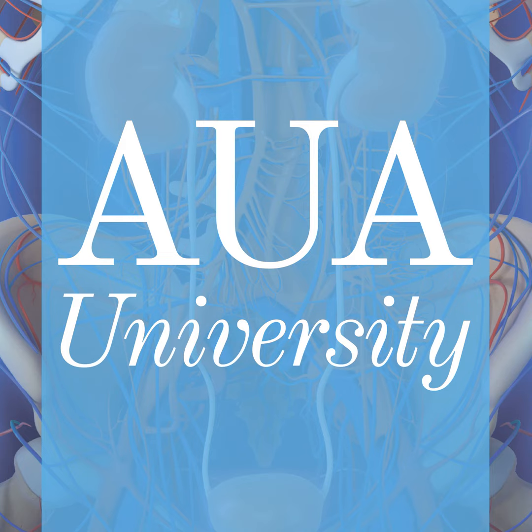The strength and dosage of Trimix, which is the author's preferred agent, is a 30-1-10 Trimix: 30 mg per milliliter of papaverine, 1 mg per milliliter of phentolamine, and 10 micrograms per milliliter of prostaglandin E1 or alprostadil, given with a starting dose of 5 units or 0.05 milliliters at the initial injection. Injection should be given at either the 10 o'clock or 2 o'clock position, anywhere along the shaft of the penis.